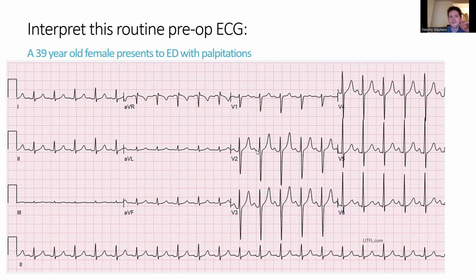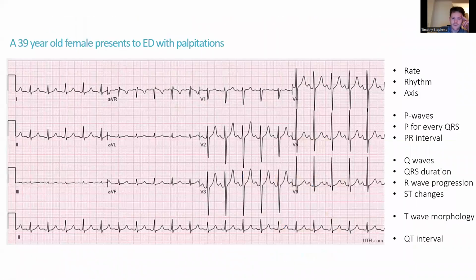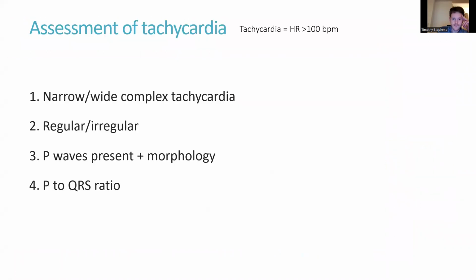One of the biggest things that I've generally found we all miss out, including myself, is the QT interval, which is particularly important for patients at risk. If you prolong the QT, you're much more at risk of having dangerous arrhythmias like VT or VF, and you can actually have some congenital conditions as well, which make you more prone to those. So don't forget your QT interval as well. All right. So that's a snapshot of how you interpret an ECG.